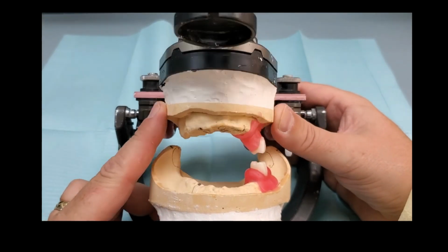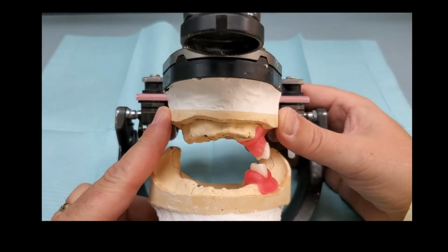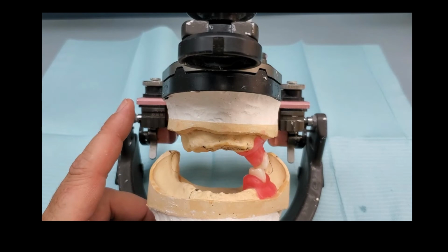That's what I want, because then I can adjust the teeth and adjust them without damaging them to facilitate how they function within someone's chew cycle that I identified clinically, and that I'm asking you to ask your dentist clinically now, because this is about creating efficiencies. Efficiencies help everybody. They help the doctor, they help you as a technician, or you as a denturist, or you as a prosthodontist that are listening, or you as a doctor that's listening, efficiencies are important so that the team functions efficiently, and the entire dental team that's there to service and help that patient that trusts us.